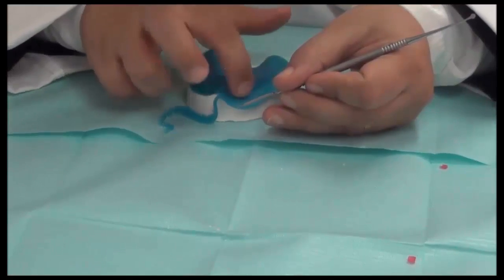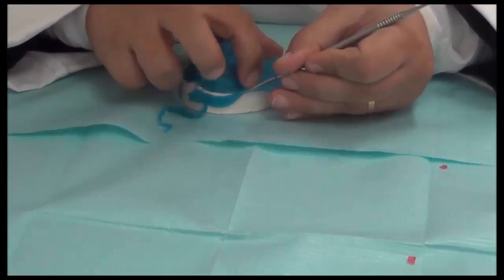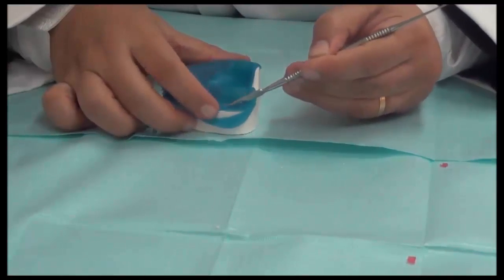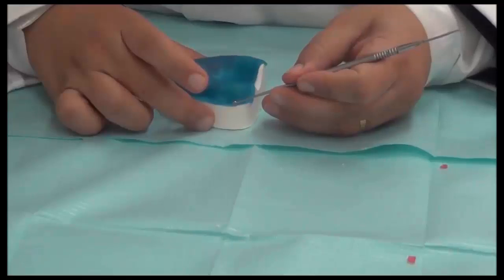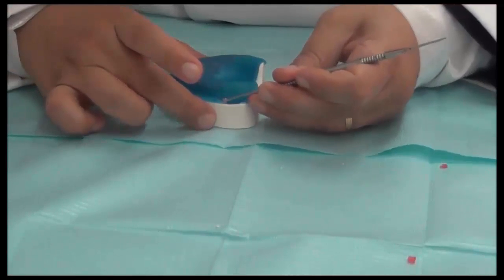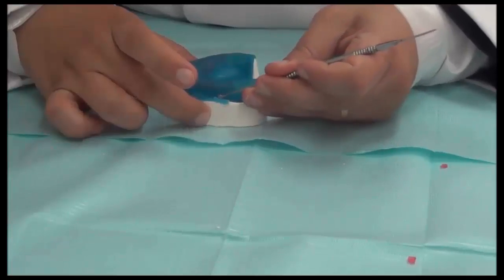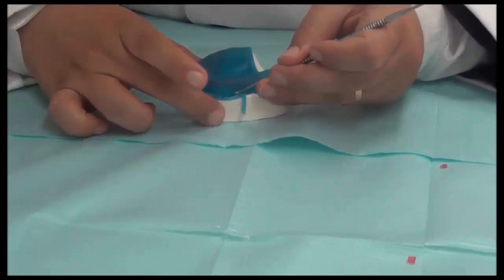And this excess comes a bit longer, so we can fold it into the sulcus once more. So adapt as much as possible, and then over the land area just remove the excess. And then by the back of the instrument, or even the back of a pencil if we have, we can adapt this material from the outside to the inside of the sulcus and then smooth it. Okay, we make sure it's fully adapted, not pressing it, not thinning it. We're just doing the adaptation step. So we keep the thickness of the material uniform.